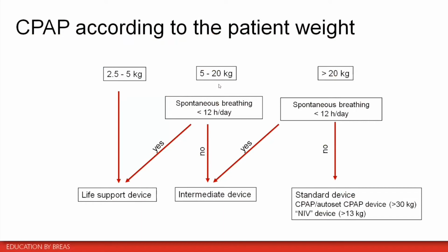Another trick is to use NIV standard devices, just because usually the flow detection is above 13 kilograms, and like this, doing constant CPAP, you will be able to get correct data. So that's a possibility: doing CPAP with an NIV standard device.